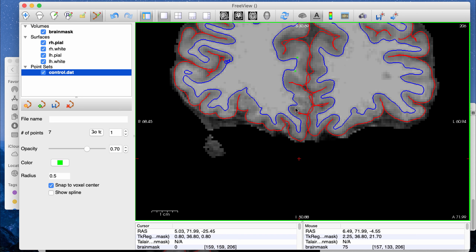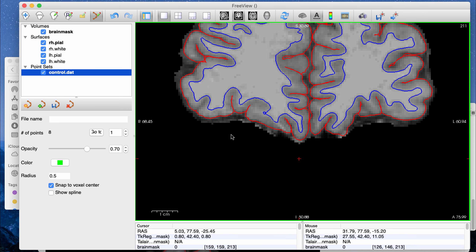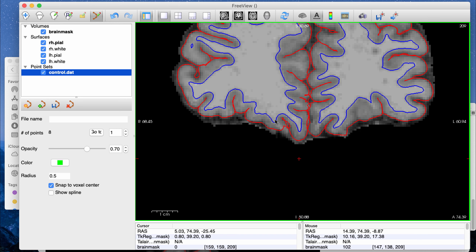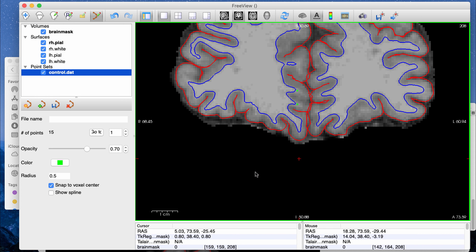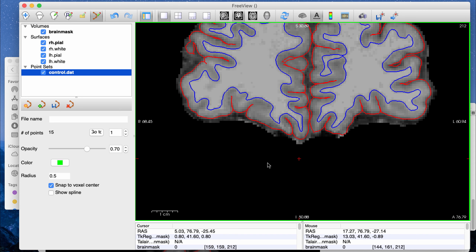I'll just add a couple of points — you can add as many as you want. A few things to keep in mind: clicking adds a dot, shift-click erases a dot, and you can click and hold to drag a dot around. Another way to erase is Command-Z to undo the last command. You basically want to check this slice by slice, just like you would do the manual peel edits.